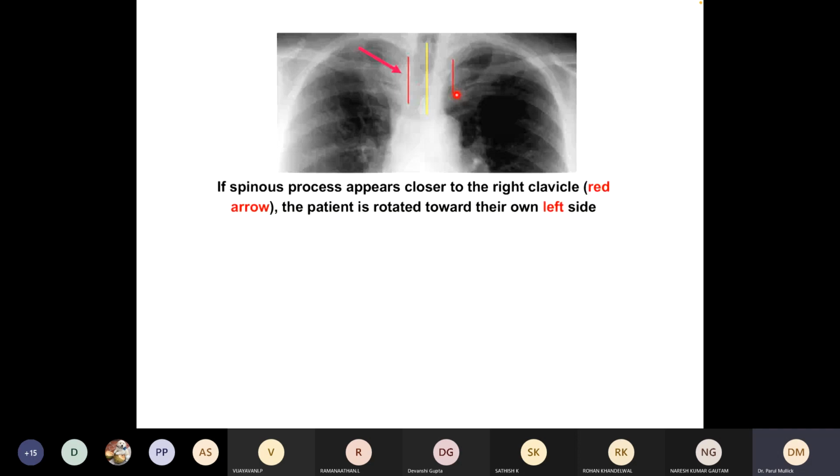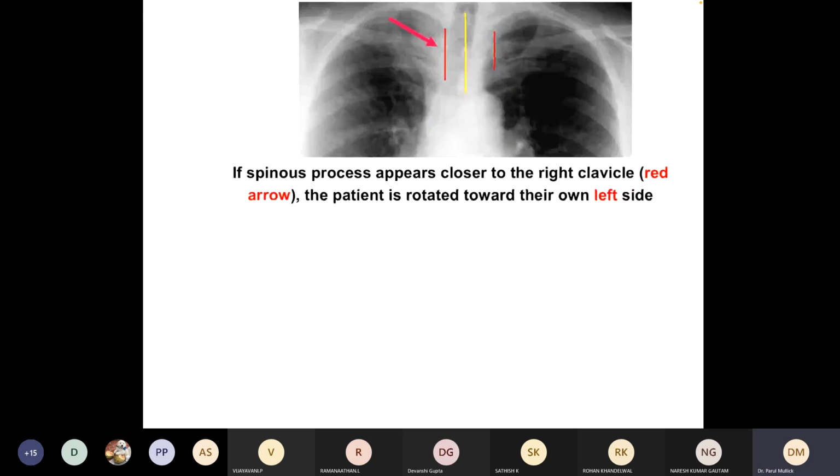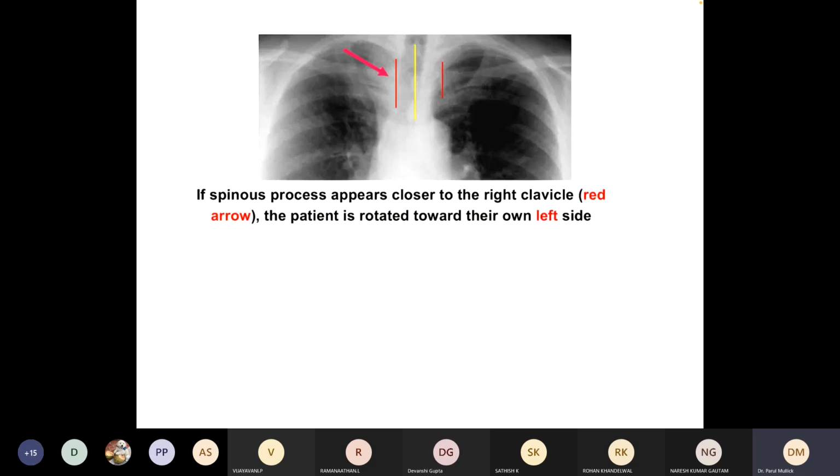ठीक है, that you will have to imagine. अब मैं ये offline class में is a little difficult for me to get that. Now फिर ये okay. एक मिनट.